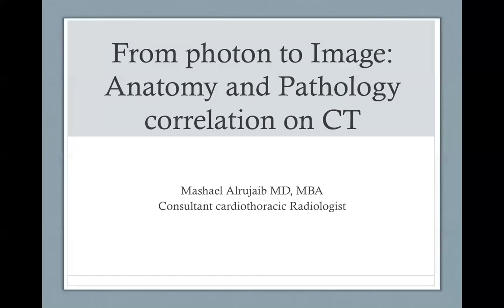The distribution of the lectures has changed a little bit. We were supposed to talk about clinical applications of CT and MRI in the previous lecture, or at least one of them, which I don't think we got to. And then we said, okay, let's leave that for the next lecture. But then the change in the schedule came because of the royal decree. So I think what I will try to do is just focus on CT in this lecture.